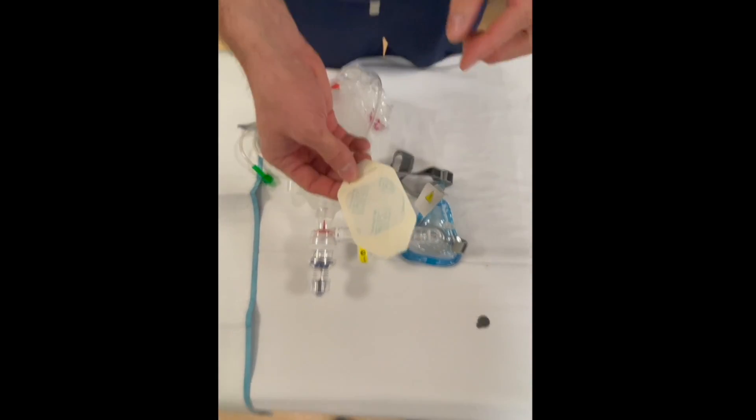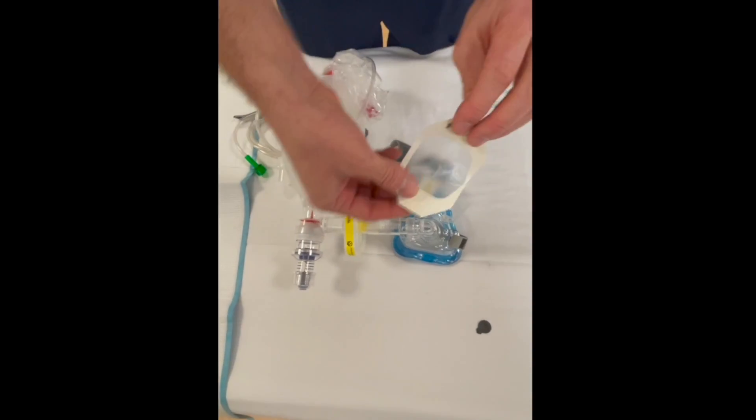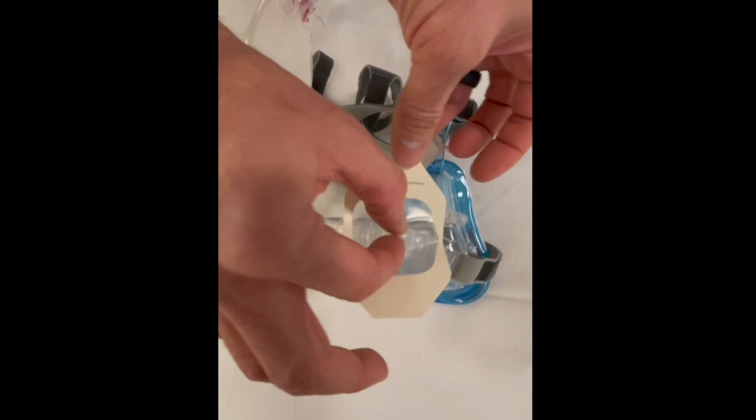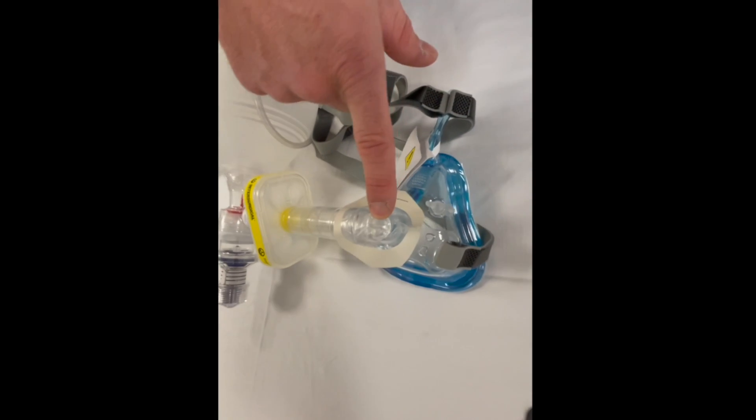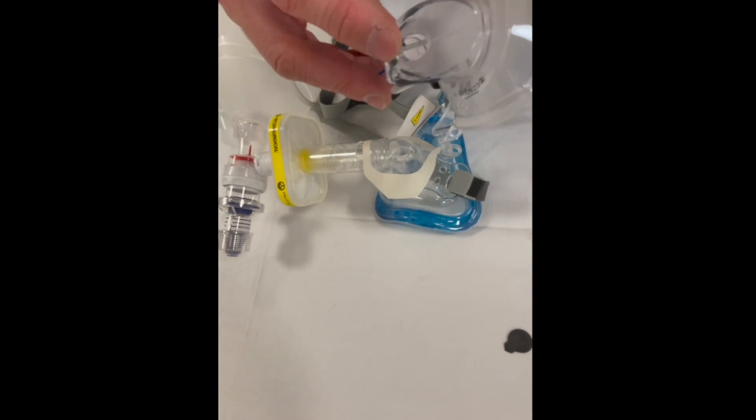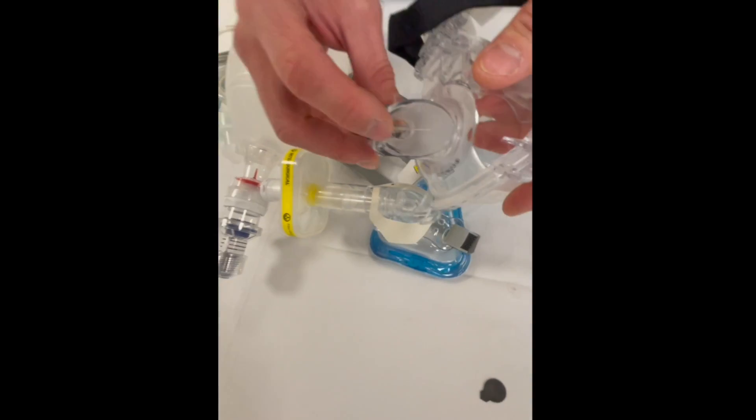We just get a tegaderm, lay it right over, and then you pinch it and wrap it around the sides to make sure that this exhaust port is covered. It's going to be the same thing on the other type of mask. You just make sure that this exhaust port is covered.